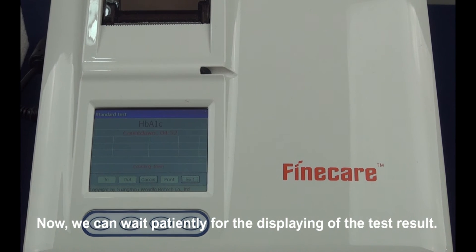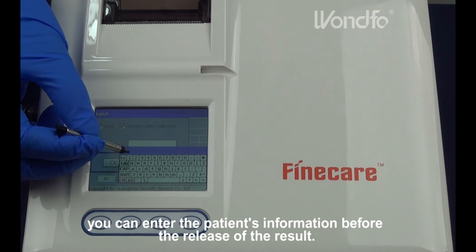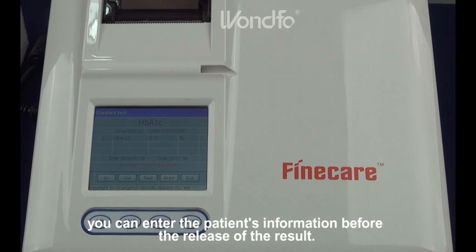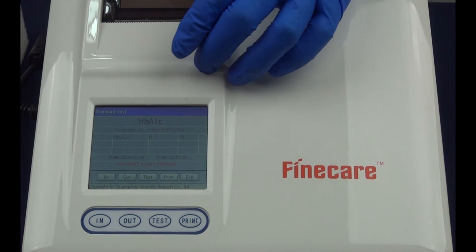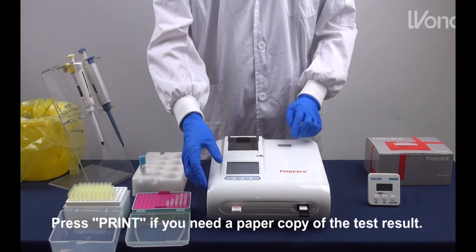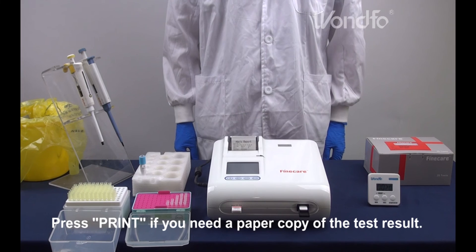Now, we can wait patiently for the displaying of the test result. When the test is done, you can enter the patient's information before the release of the result. Press print if you need a paper copy of the result.